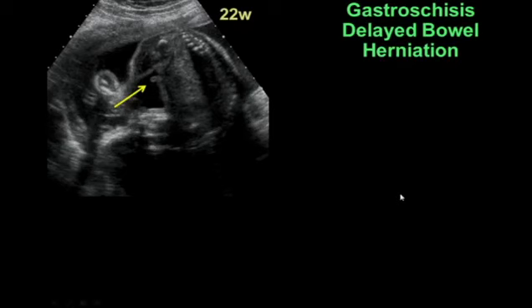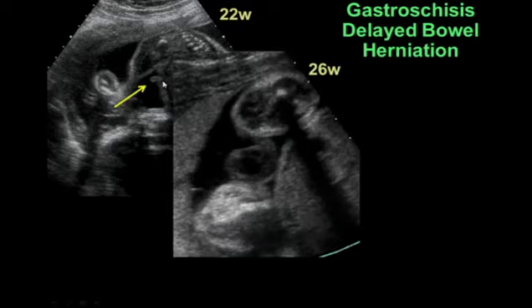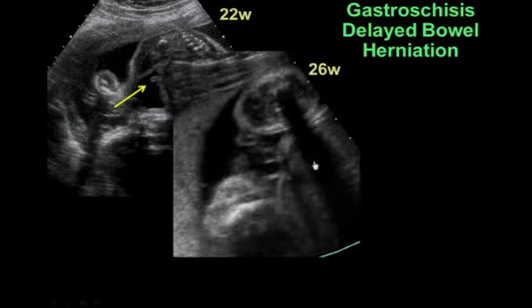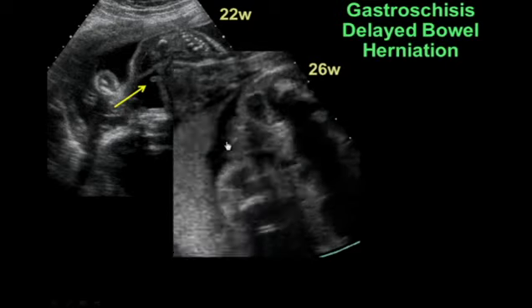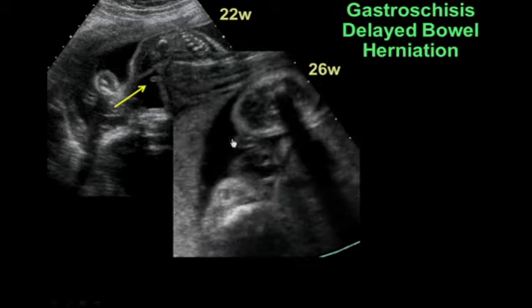This is an interesting case. This fetus proved to have a gastroschisis, but we made the diagnosis late in pregnancy because of delayed herniation of bowel through the defect. At 22 weeks gestation, we saw a little bump protruding from the anterior abdominal wall, and we thought this might be a dermal lesion, something related to the fetal skin, because everything else was completely normal. On follow-up scan at 26 weeks, now this lesion was just a little tubular structure. It was this small little tube protruding next to the umbilical cord insertion.